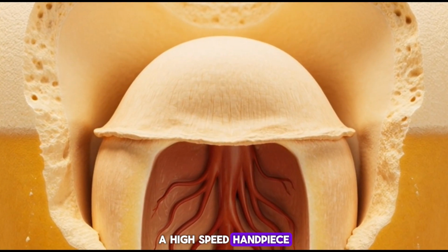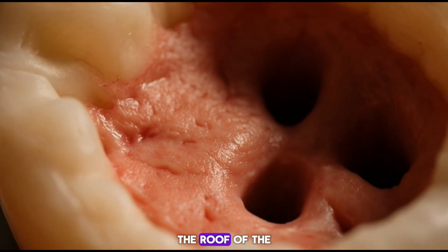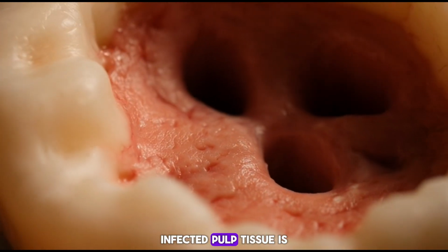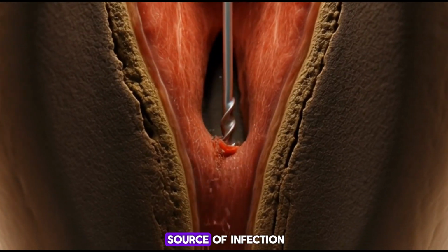A high-speed handpiece carefully removes weakened enamel and decayed dentin, creating a small opening into the pulp chamber. The roof of the chamber is refined to reveal the canal orifices. Infected pulp tissue is then removed using fine endodontic instruments. This process, called pulpectomy, eliminates the source of infection.